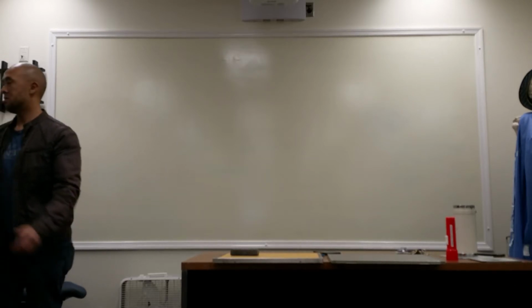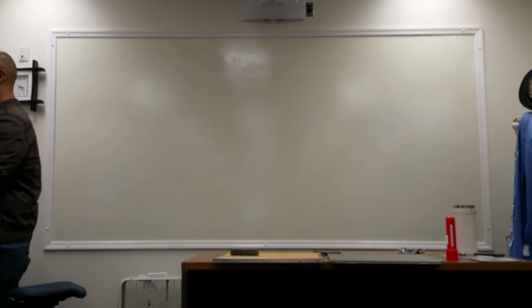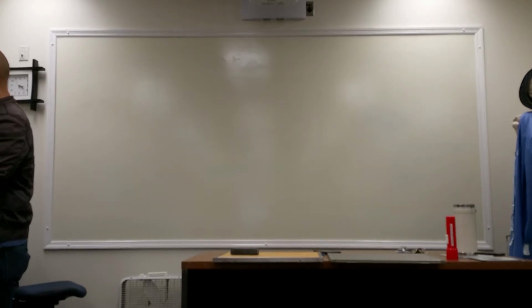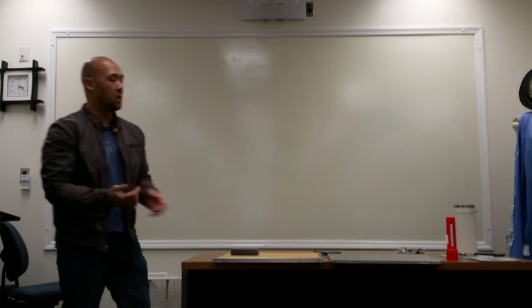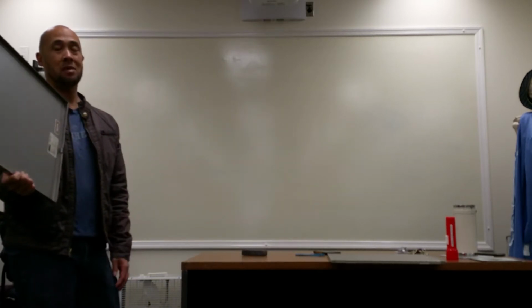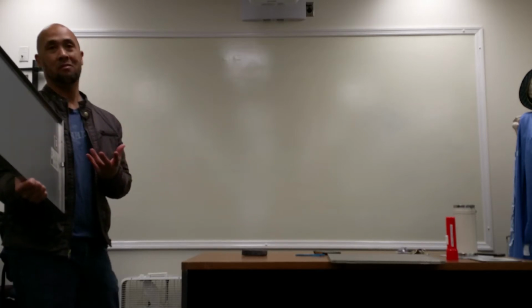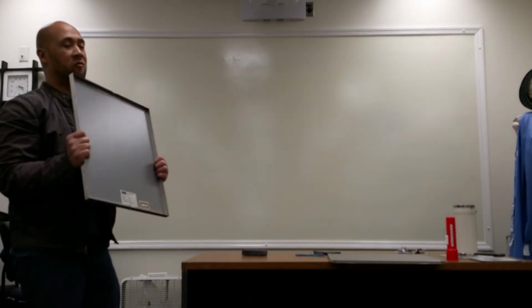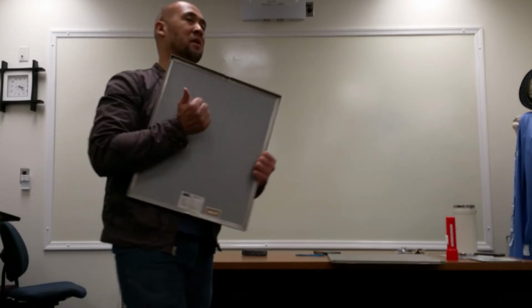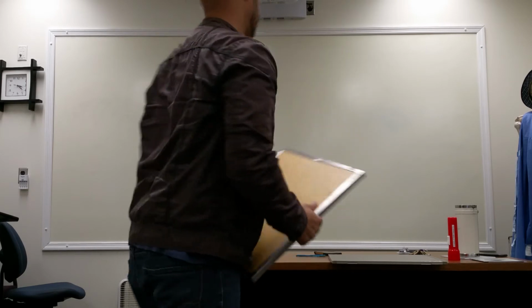Is the grid part of like the bucky tray, or is that something else? Okay, so the question is, is this part of the bucky tray. What I'm going to do is introduce to you two ways in which the grid is employed. One would be portably outside of the department, and the other one is actually built into the construction of the table. But for intents and purposes, so you guys have a better understanding, I'm going to utilize the portable one for demonstration.